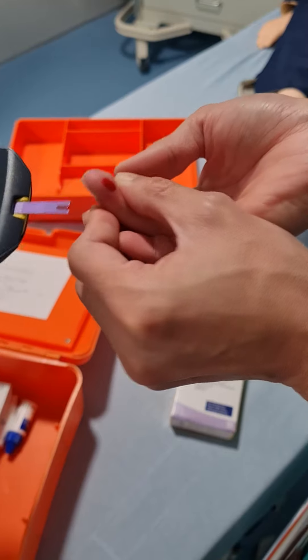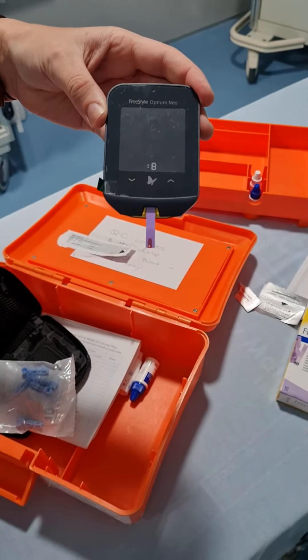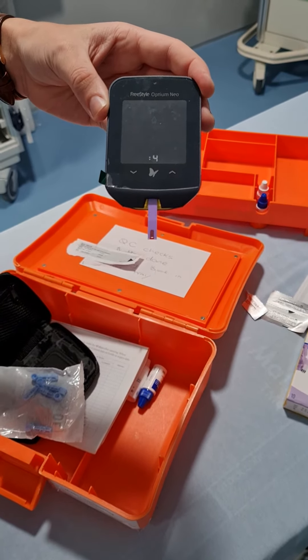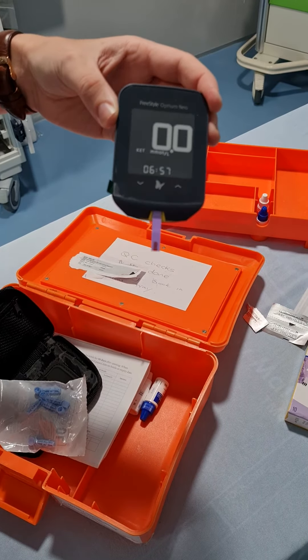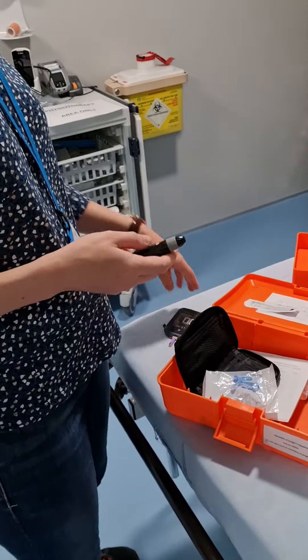You let the blood go right up, and you can see a number coming up, then it counts down. The result is zero — success!